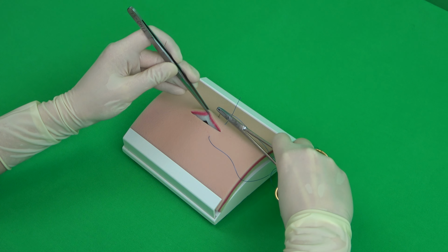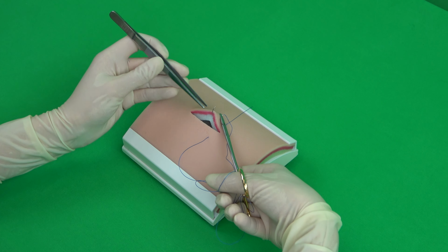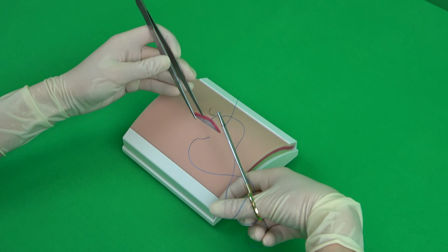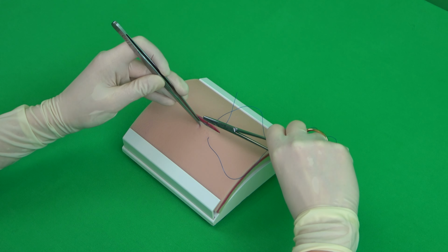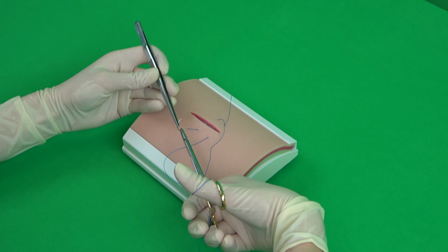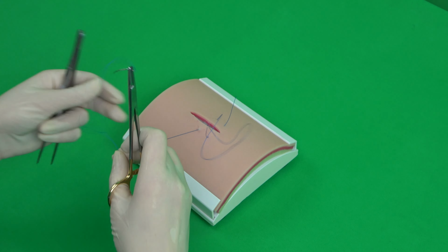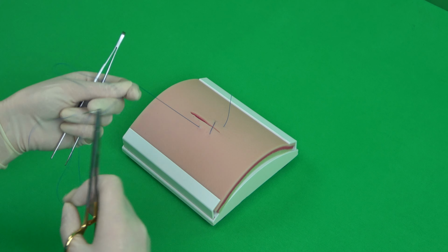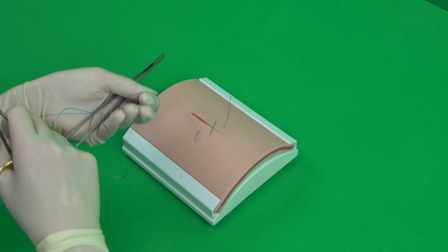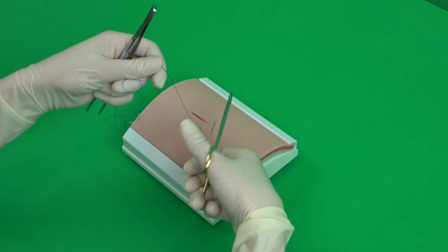After this, the needle is driven through, perpendicular to the wound once more, however, next to the initial placement. The cruciate suture can be fixed with a surgical knot.